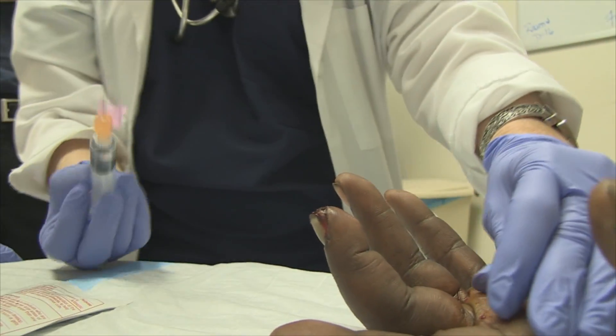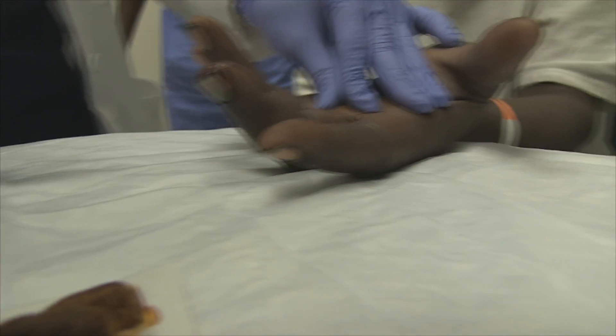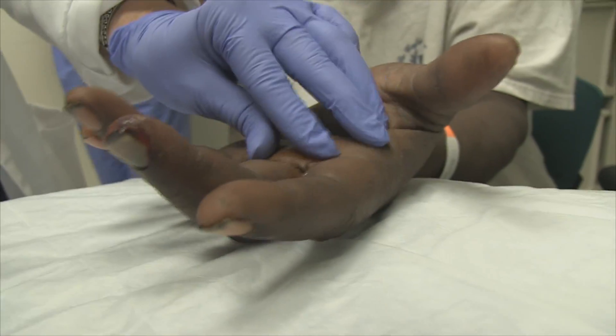Now, is this your first digital block too? Well, I've done it on the toes.